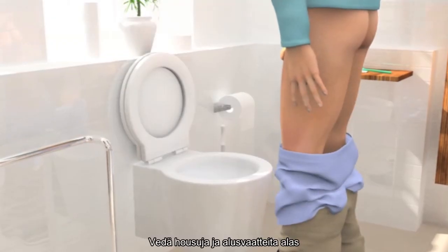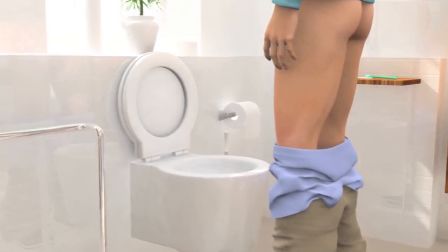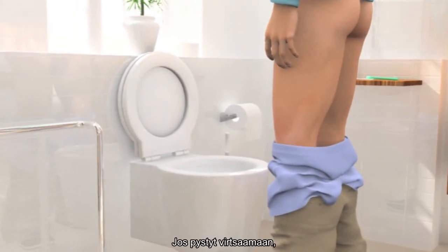Pull your trousers and underwear down and stand in front of or next to the toilet. If there is a possibility you may be able to pass urine, always try to before you use a catheter.